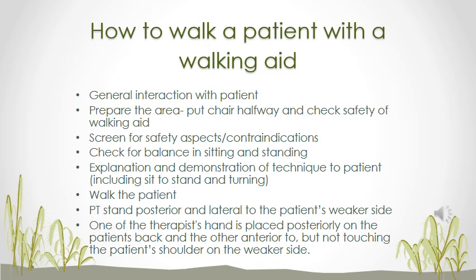Thereafter, if they are safe, you feel that you have educated them well enough, then you start walking. Remember, if their balance is not good, then the parallel bars can provide a safer area for them to walk in and to gain the necessary balance and strength.